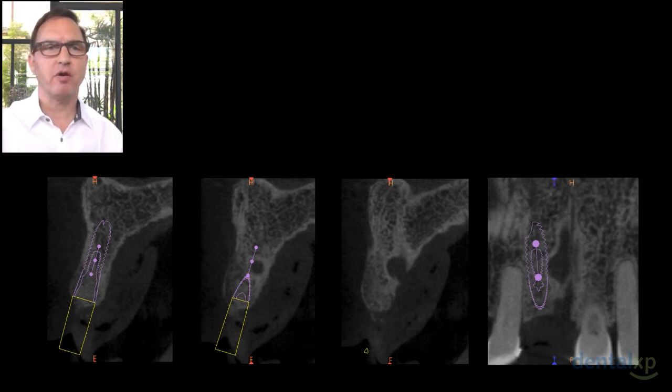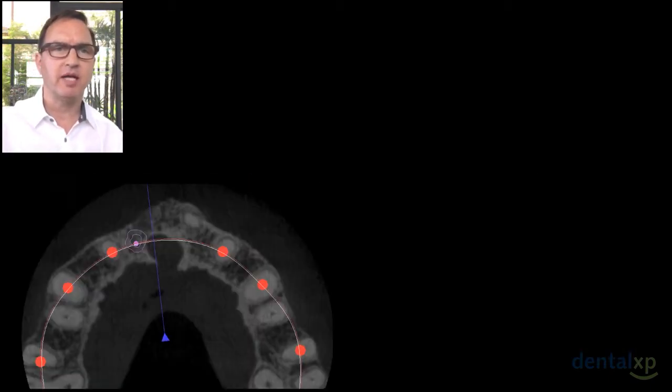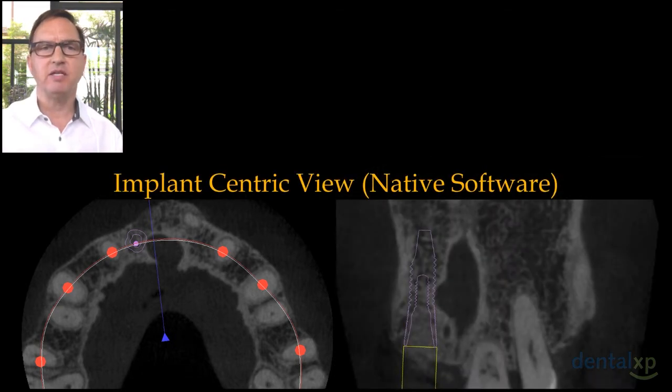When viewed coronally, or in the axial view, you can see there's also the buccal plate. So between the lateral incisor, the buccal plate, and the outcropping of the incisive foramen, one might acknowledge that this would be relatively challenging to position the implant. So in this instance, even if there is enough bone, does the software alone give you the ability to actually execute on that proposed plan or that conceived plan?